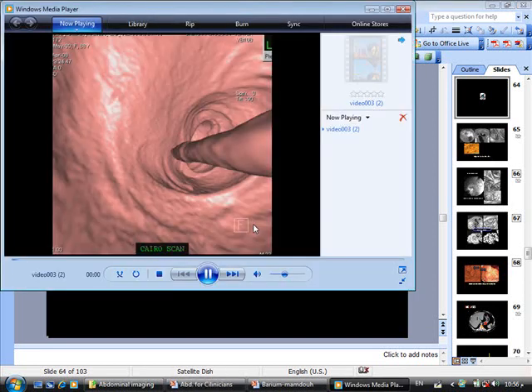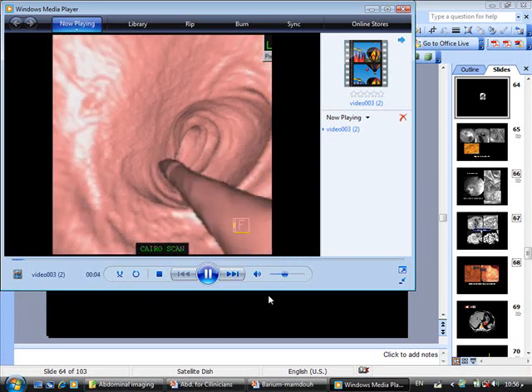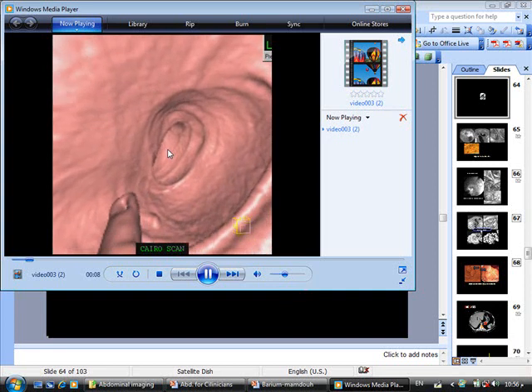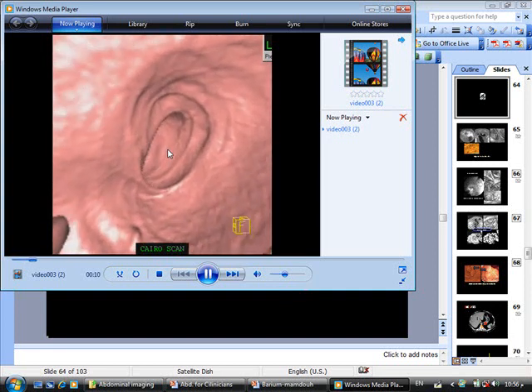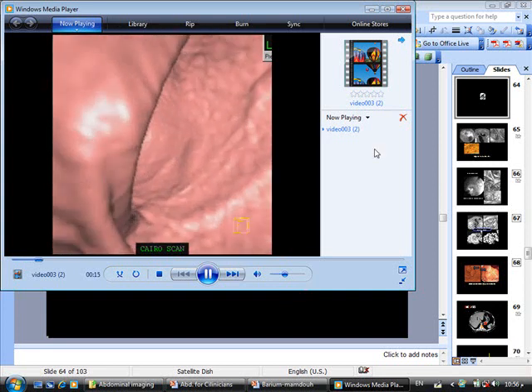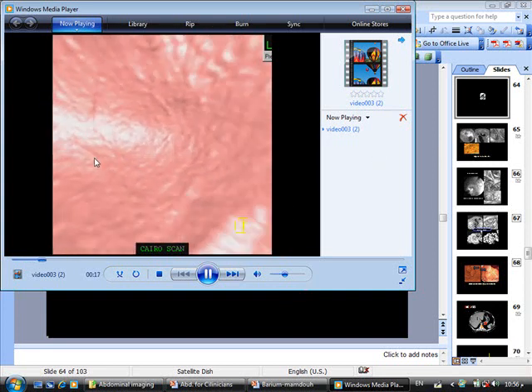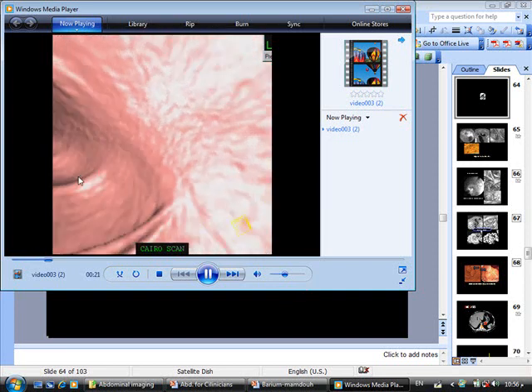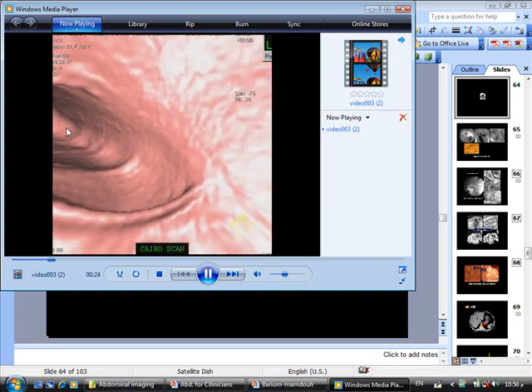You see, like this, you just push a button on the machine, which initiates what is known as the virtual camera. Then you can move inside the image of the colon to see its inner aspects. You are going by the camera, then you hit the colonic wall, then you change the direction of the camera and go inside this lumen, like this.